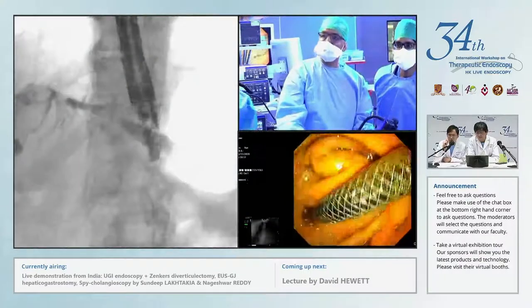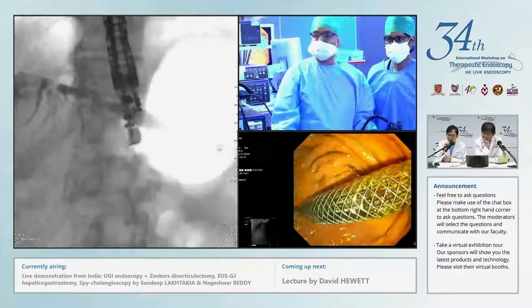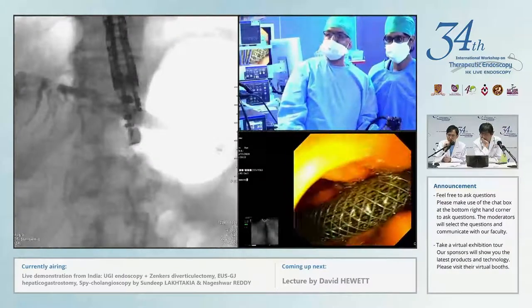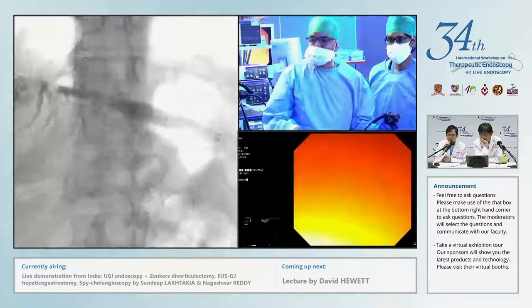And then you get a good length of the stent in the stomach. Really long, but yes. So this is a long segment in the stomach, but this will shorten over the next 2 to 3 days. And if you do an endoscopy, this stent will be only 2 to 3 centimeters outside the stomach wall. And this is a perfect position. And if you have the fluoroscopy, I think that looks very nice.